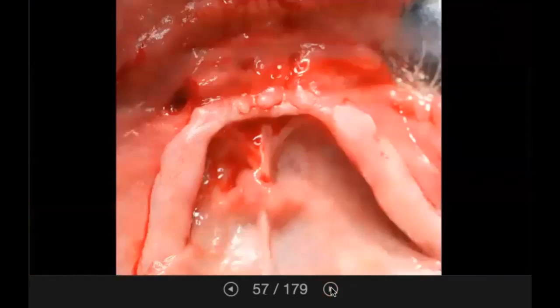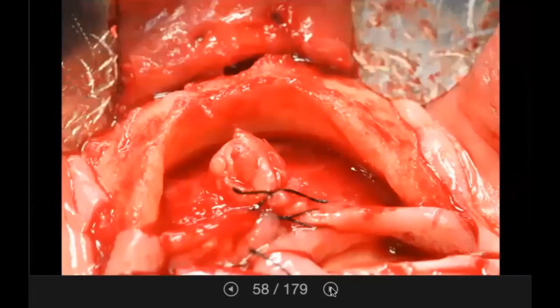After skeletal fixation pins are drilled, the guide based on the denture replication is removed. A full thickness mucoperiosteal tissue flap bisecting the keratinized tissue is elevated to expose the mandibular alveolar crest and buccal and lingual flange in the areas of proposed implant placement. Note the knife edge mandibular ridge. Care is taken to place the incision through the keratinized tissue for the overall periodontal health of the future implants.